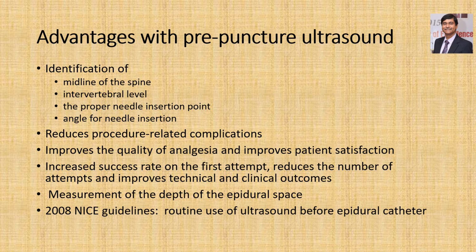There is an increased success rate on the first attempt, so the number of attempts is reduced, and this improves technical and clinical outcomes. We are able to measure the depth of the epidural space, which means we are able to measure the distance between the skin and the ligamentum flavum. This avoids accidental dural puncture. NICE guidelines 2008 recommend the routine use of ultrasound before epidural catheter placement.